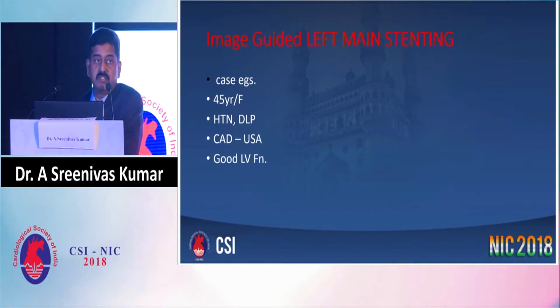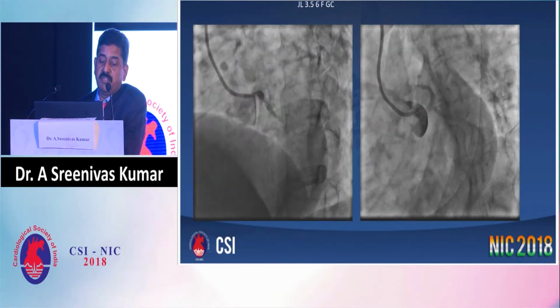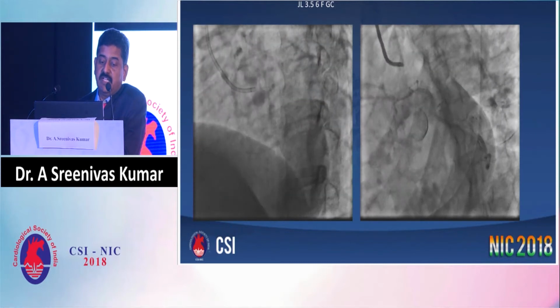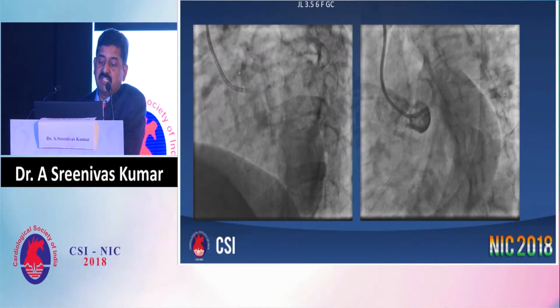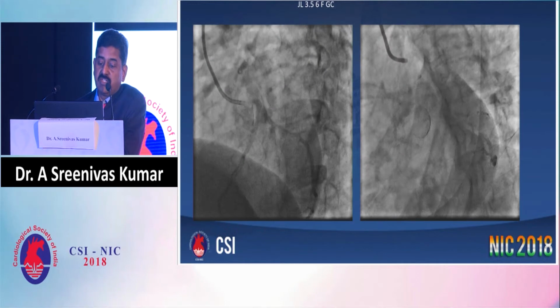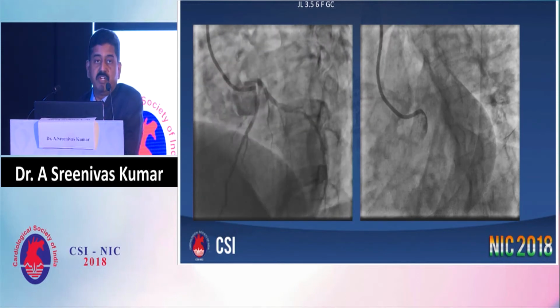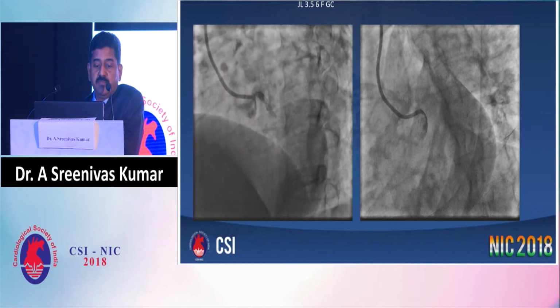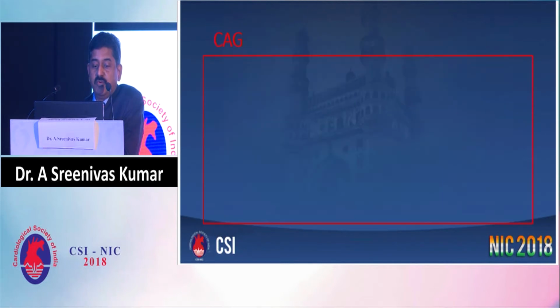It was thought to be non-cardiac outside, then CT angio was done and showed very tight left main disease. We had some information about osteal left main, so that's how we selected the JL catheter. As you hook it, it used to get damped, so we were mentally prepared, took 1 or 2 check shots, and then went ahead with the procedure. It's very important to prevent complications rather than tackle them. Because we had an idea beforehand of suspected osteal left main, we could do it.